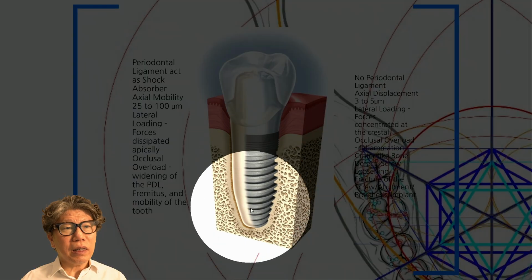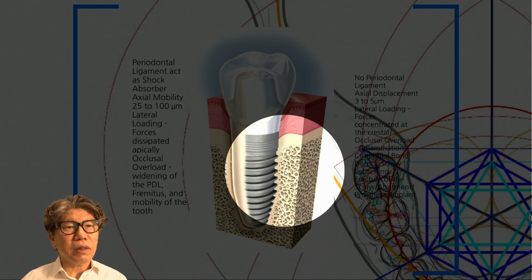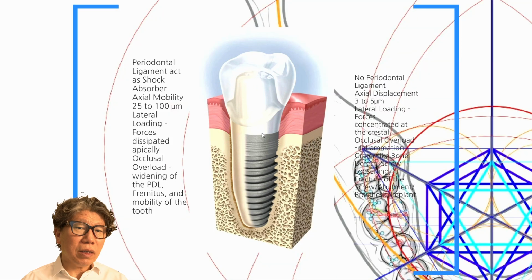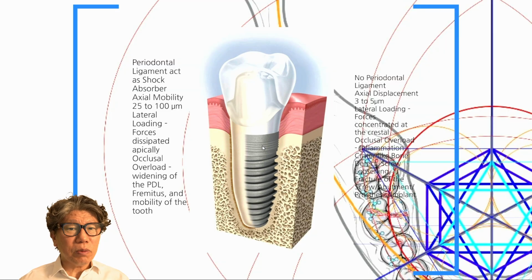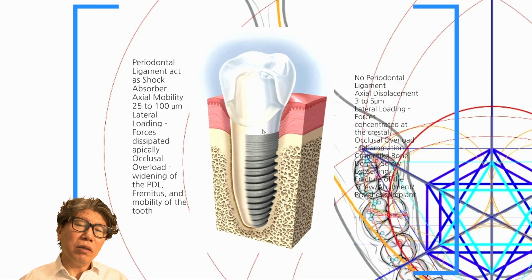If you consider the reason, it's because the support is too rigid. So there is no role for stress breaking, which sometimes results in stress concentrating at the connection areas between the screw, abutment, and fixture. There used to be an implant called IME implant. In the case of the IME implant, it added a plastic component that could absorb shock, functioning as a shock absorber. This component absorbed the stress coming from occlusal forces. This innovation once gained sensational popularity.